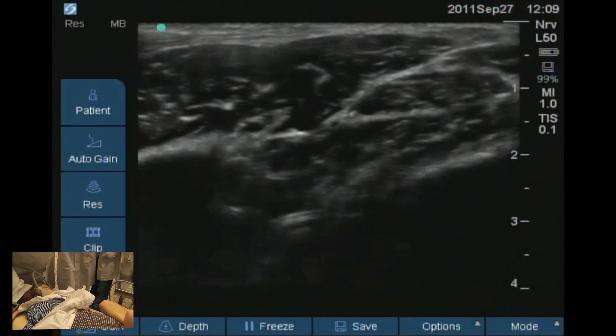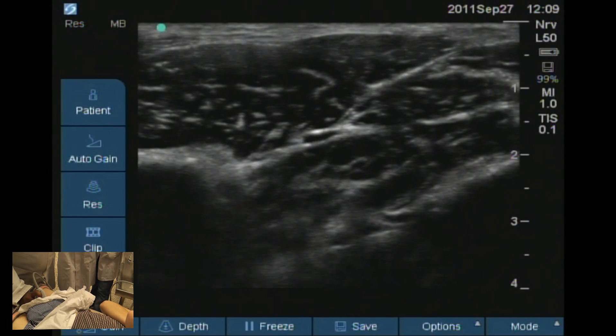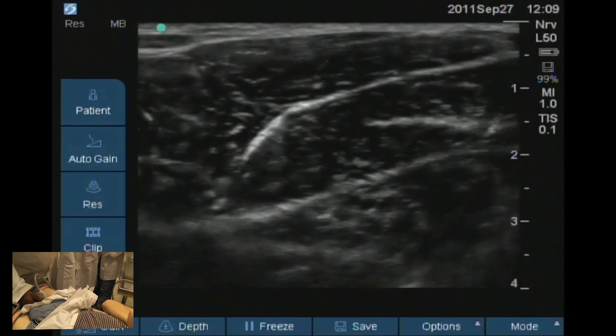These are your adductor muscles and that's your pectineus. They are just grouped up here, and then they divide into two — one goes along this plane and one goes along the other plane.